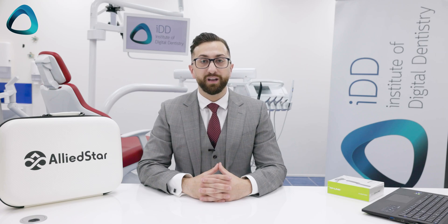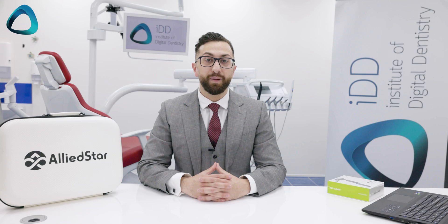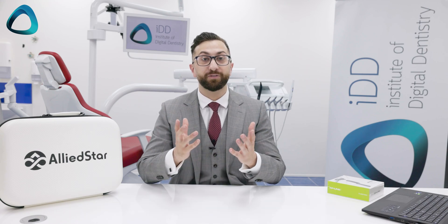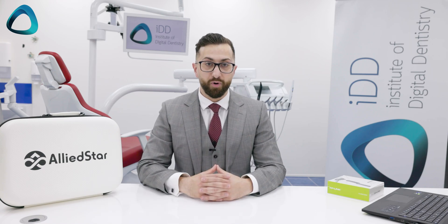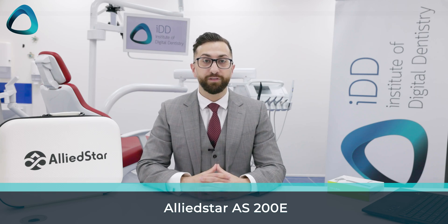Some of you may be wondering who is Alliedstar. They are an intraoral scanner manufacturer from Shanghai, China. I reviewed their previous generation scanner, the AS100, last year, and found it to be one of the best low-cost scanner options — fast, economical, and accurate. Now the company has released their second-generation product, the AS200E, a wireless version of that scanner.